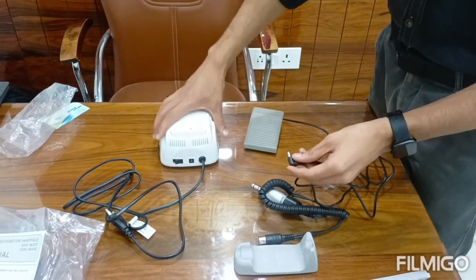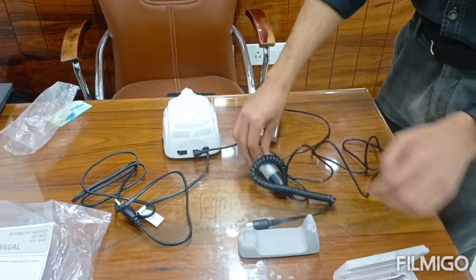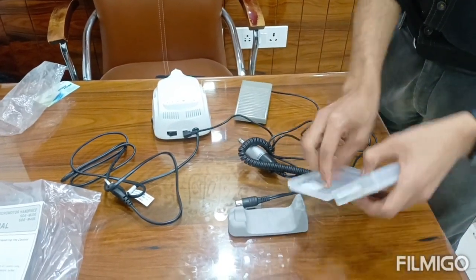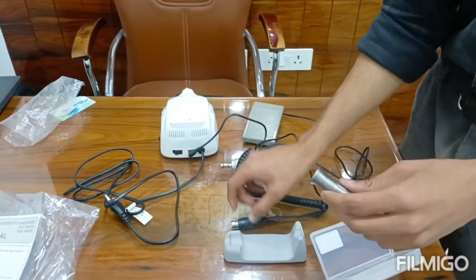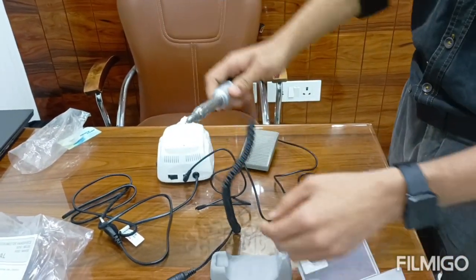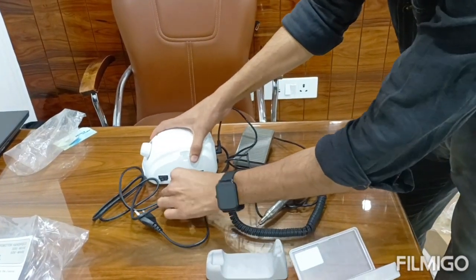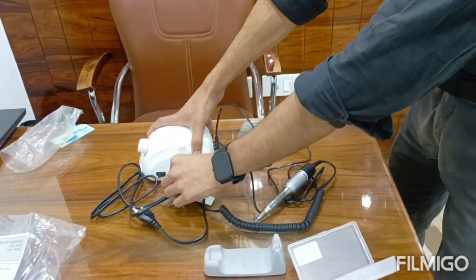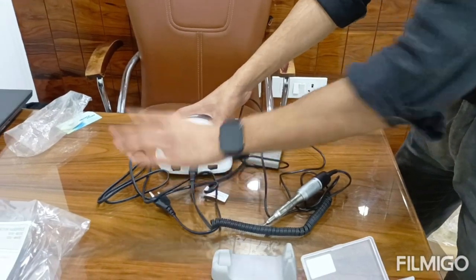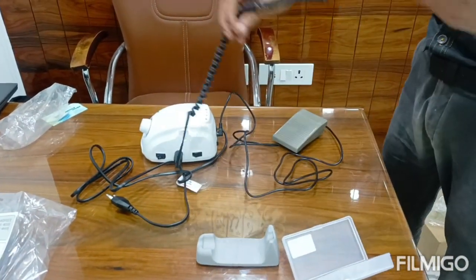Now we will connect the foot pedal and hand piece. Connect the foot pedal and connect the hand piece. All accessories have been connected.